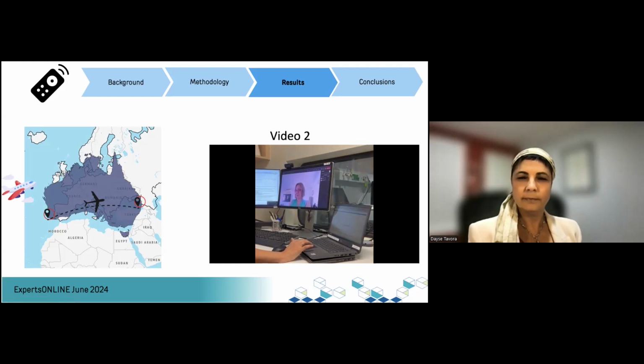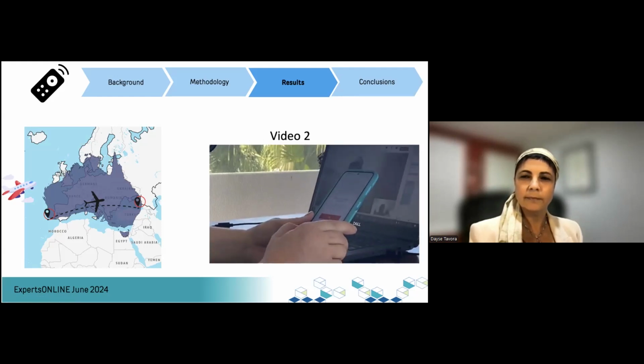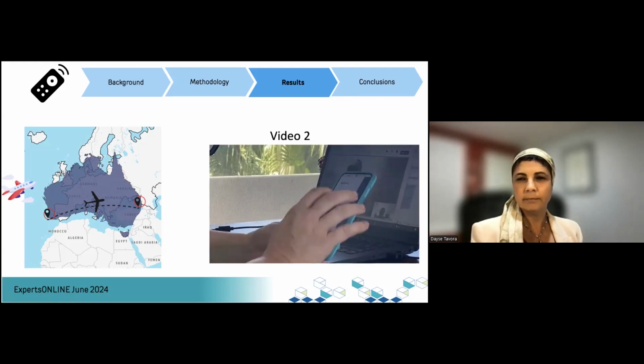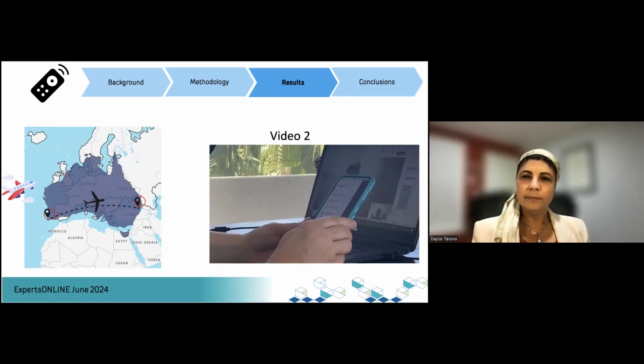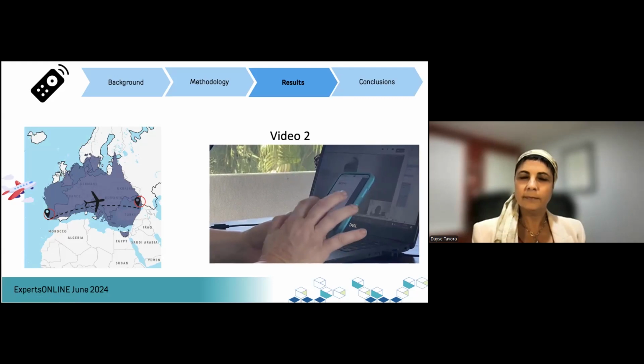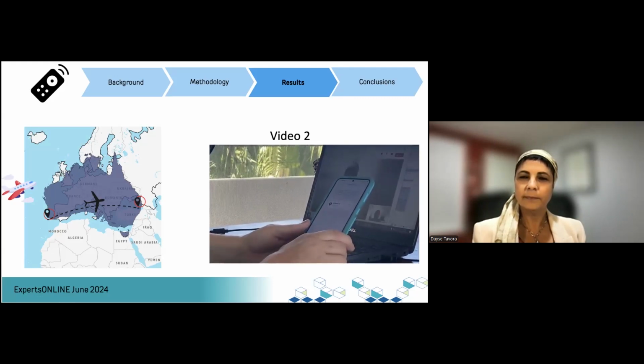I need you now to go back to the menu again. Yes. Oh, I've got a little new configuration available. It just popped up onto my, without even going to the, yeah, I've gone back to the dashboard. Yes. And I'm going to click on remote care, configurations.